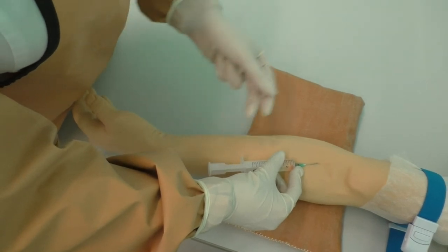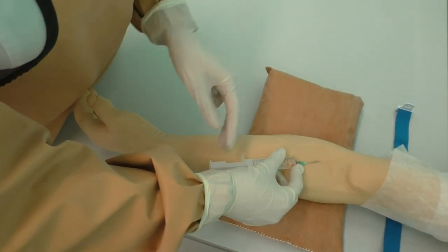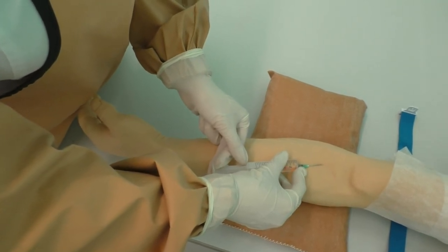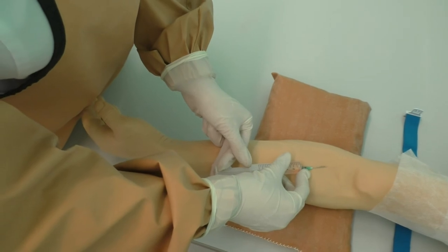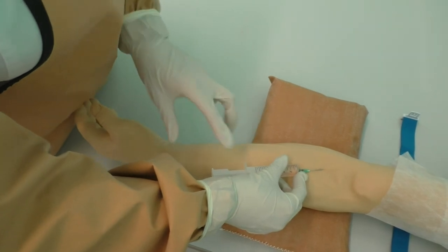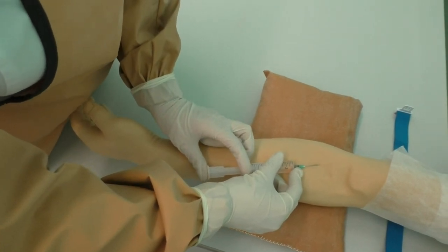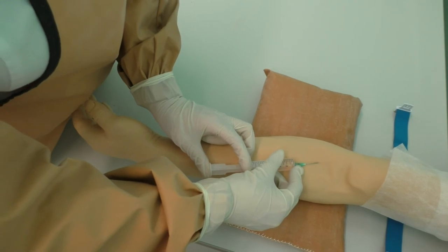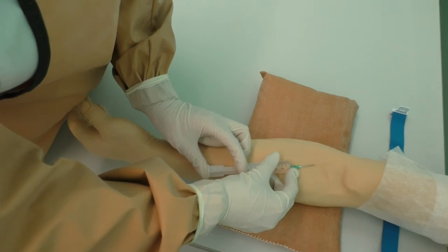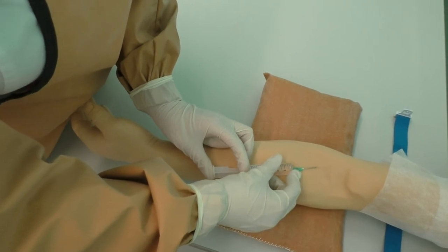Draw the blood into the syringe and release the tourniquet. Draw the blood into the syringe a second time by pulling the syringe plunger. Place the second and third fingers of the left hand on the syringe barrel and the first finger on the plunger. Inject the medicine slowly without changing the position of the syringe, pressing the plunger with the first finger of the left hand. Leave 0.5 ml of drug in the syringe barrel to prevent air embolism.